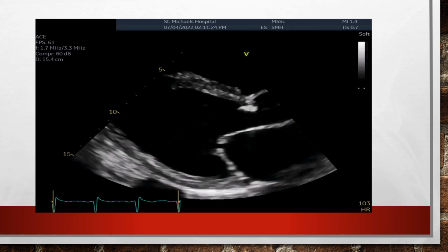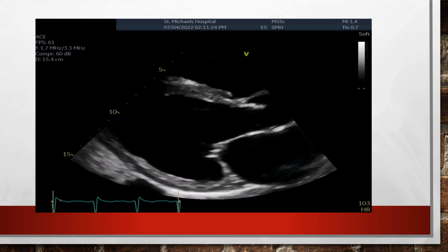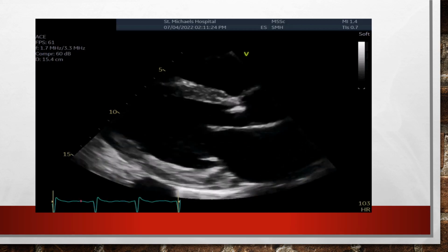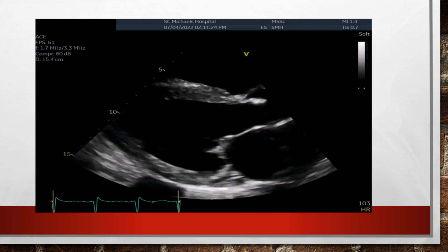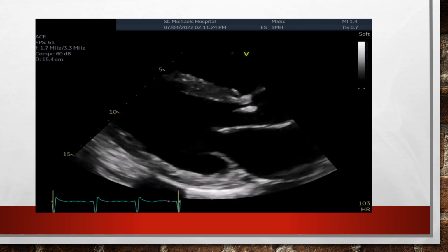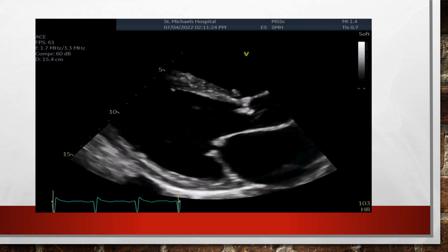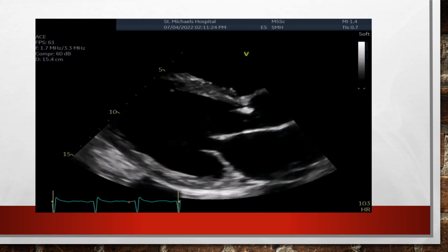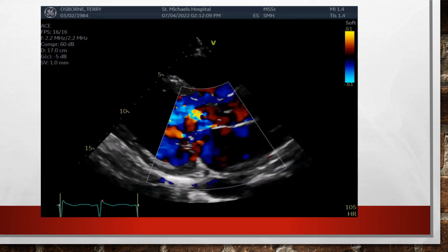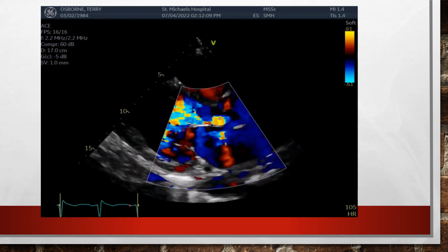Looking at this transthoracic echo, it looks different from our first case, where here you see a dilated LV cavity. LV function looks mildly to moderately reduced. There is apical tenting of the mitral valve consistent with dilated LV, and you would expect functional MR. There is a mass attached to the aortic valve that's prolapsing into the LVOT during diastole. It has echogenic independent motion. When you put color, you start to identify the presence of severe aortic regurgitation.